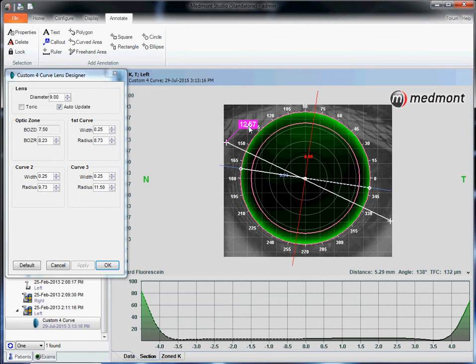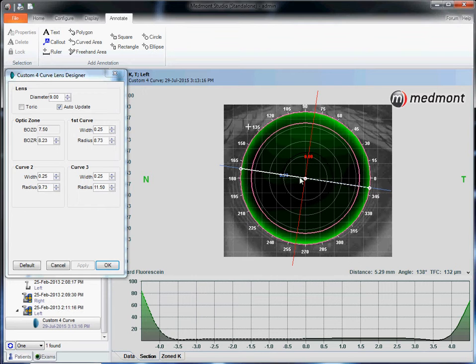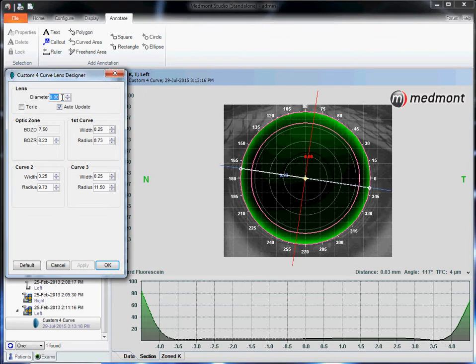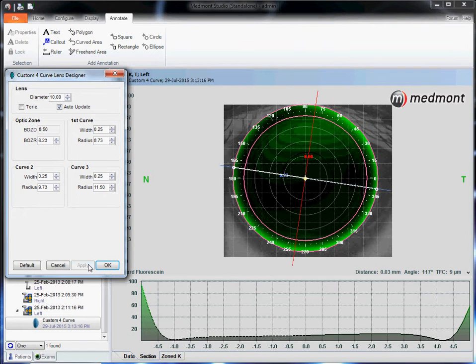Slightly larger than the norm of about 11.8 to 12 millimeters. That will cause us to choose a slightly larger than standard lens of 10 millimeters and apply.